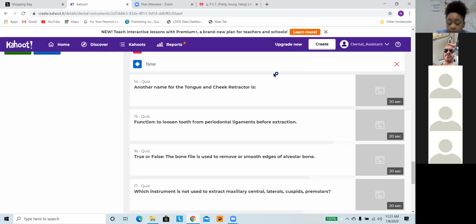Misty, I have a question. With the rubber dam stopper and all that, that's endo, right? Yes, we can use the rubber dam on endo. Actually, if it's your doctor's choice, you can use the rubber dam on any procedure because it's a protective method for the patient.